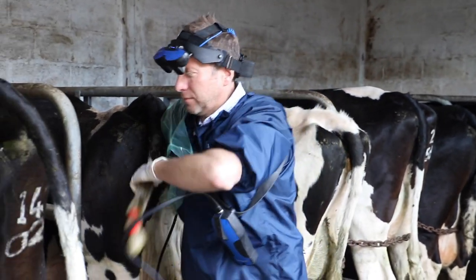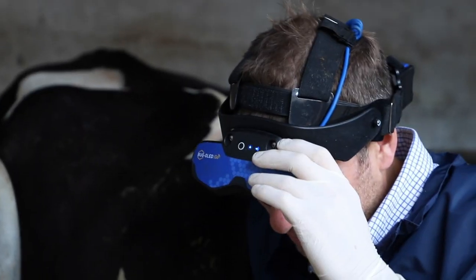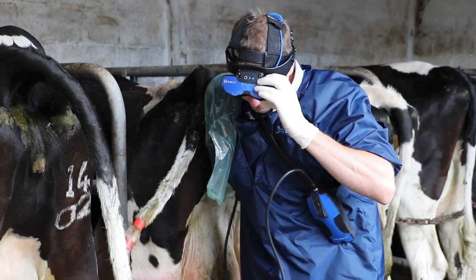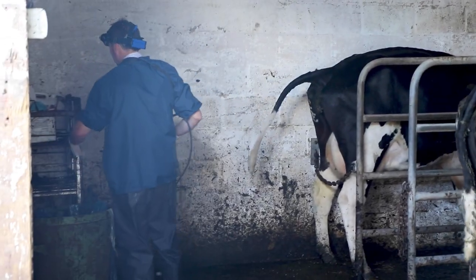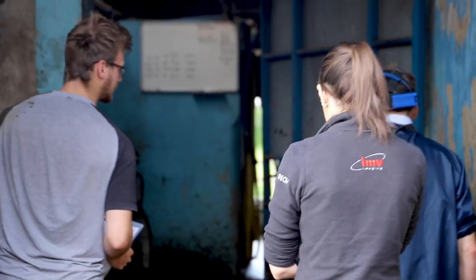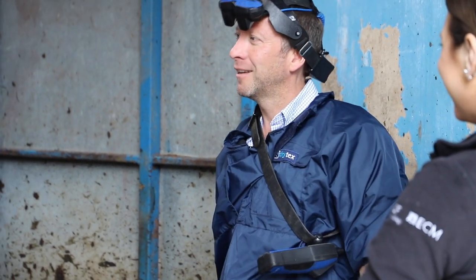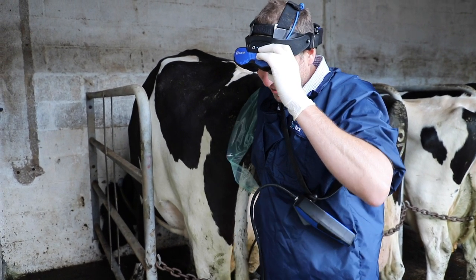Farm practice is broadly speaking very similar to how it was even 50 years ago — cows need to be made pregnant, scanned for pregnancy, and then they need to calve, and that same pattern is followed over generations. But I think it's really important to be at the forefront of technology. Farmers expect modern technology from their vets, and I think it reflects well on the profession as well as making life easier for us and giving a better result to the farmer.